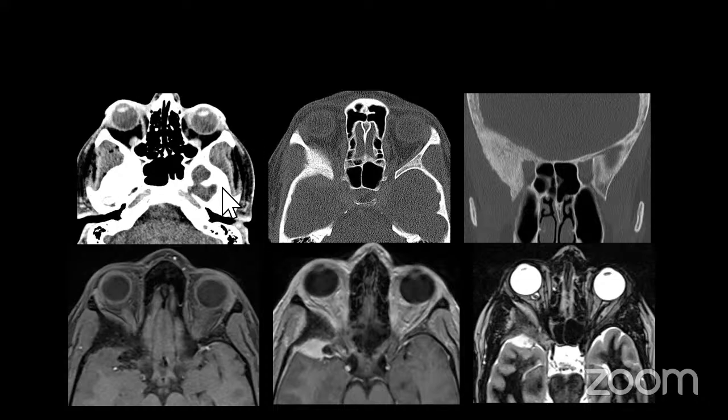So this is a patient that presented with a mass involving the right orbit. And notice on the regular soft tissue windows, maybe with a leap of faith, there's a little bit of expansion. One of the things I always emphasize, especially when you're looking at the skull base, is to take your regular data and reconvert it into bone algorithms. When you do, all of a sudden you see this spiculated mass, an intraosseous mass involving the lesser wing and the greater wing of the sphenoid. And when you see this, you can suggest the proper diagnosis.